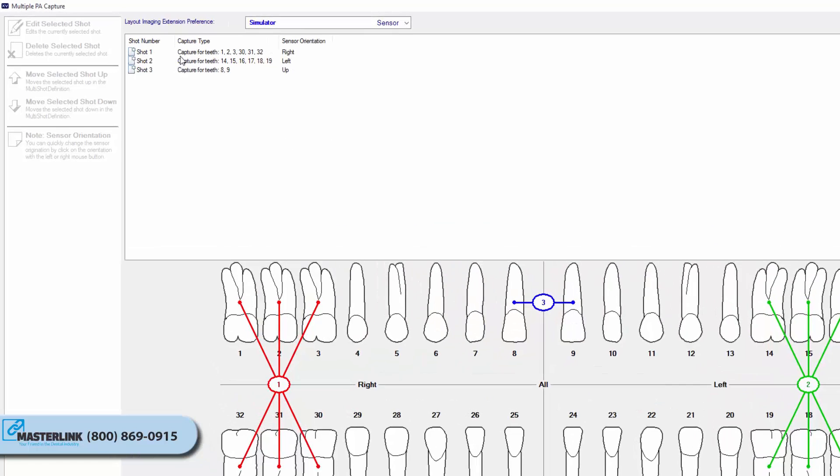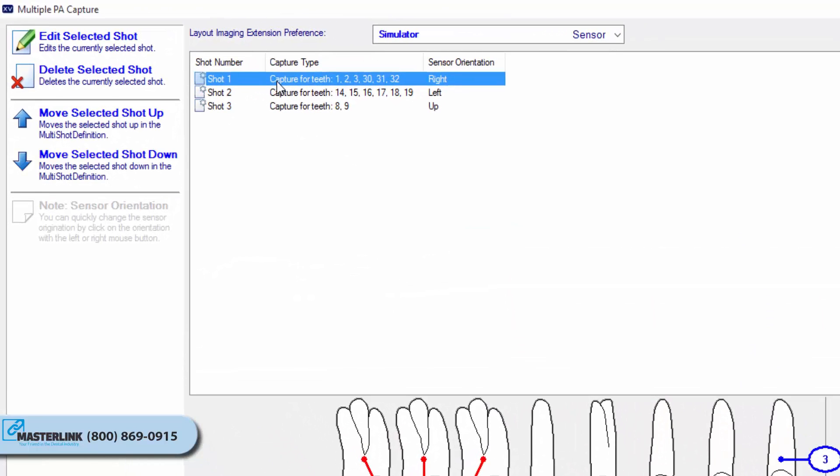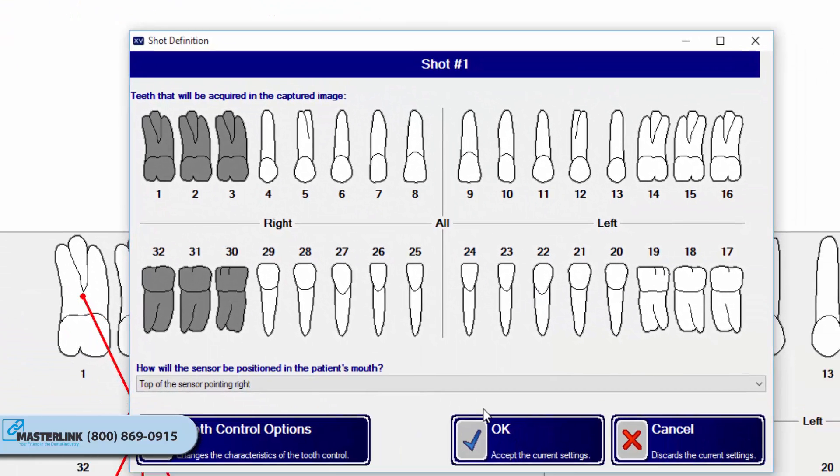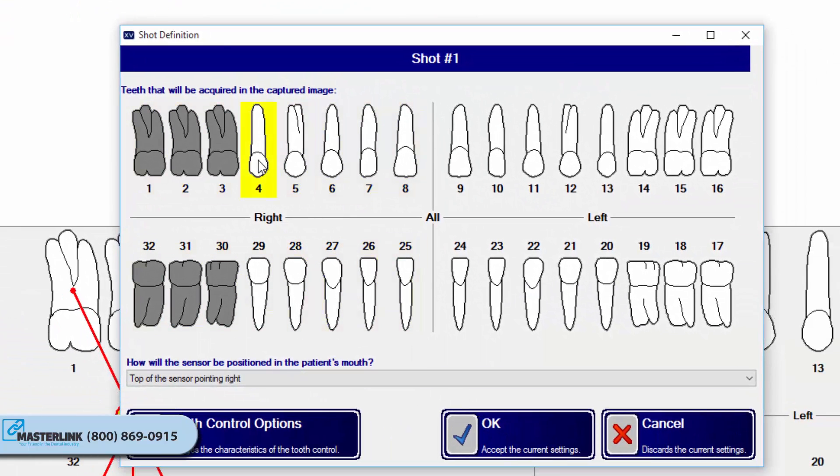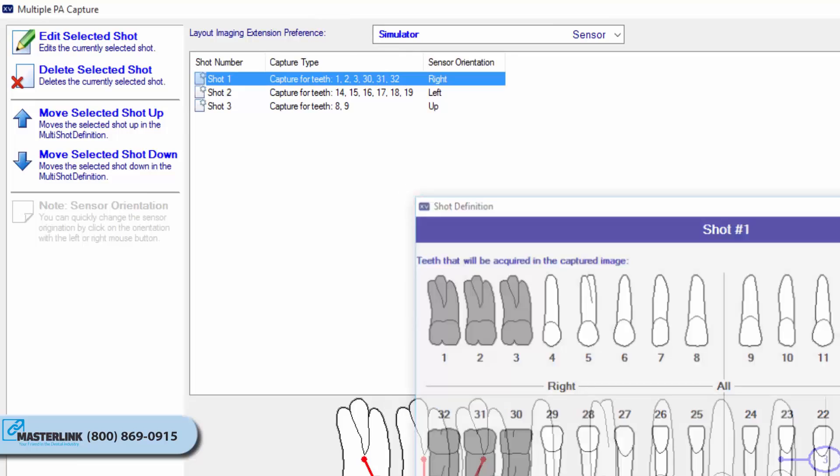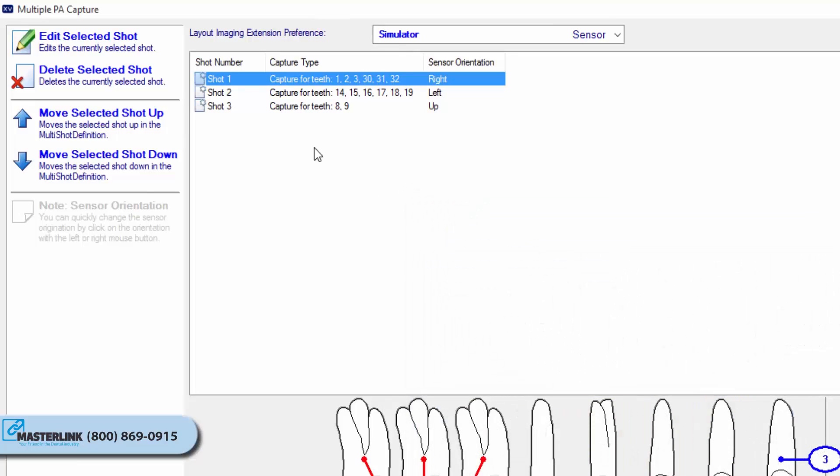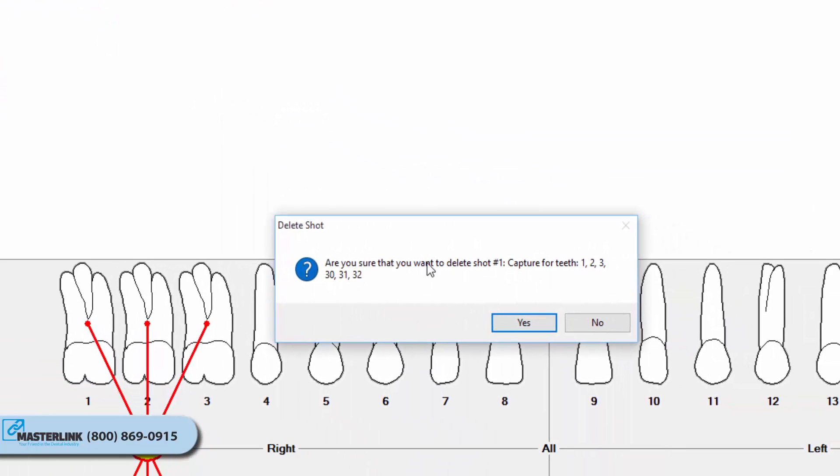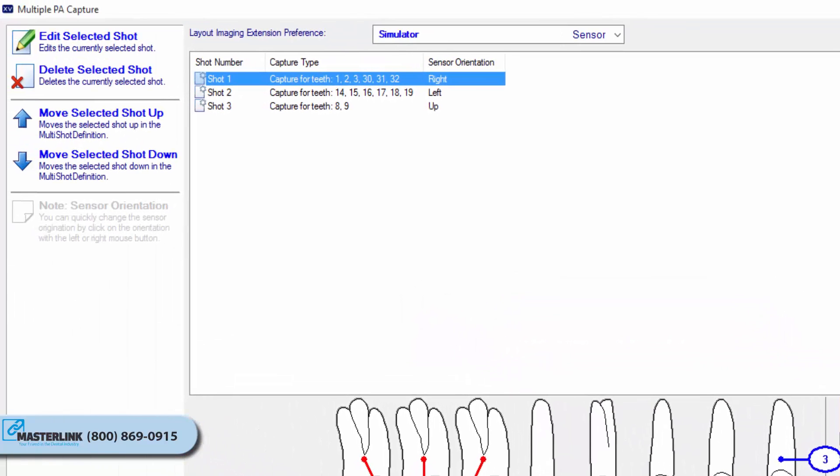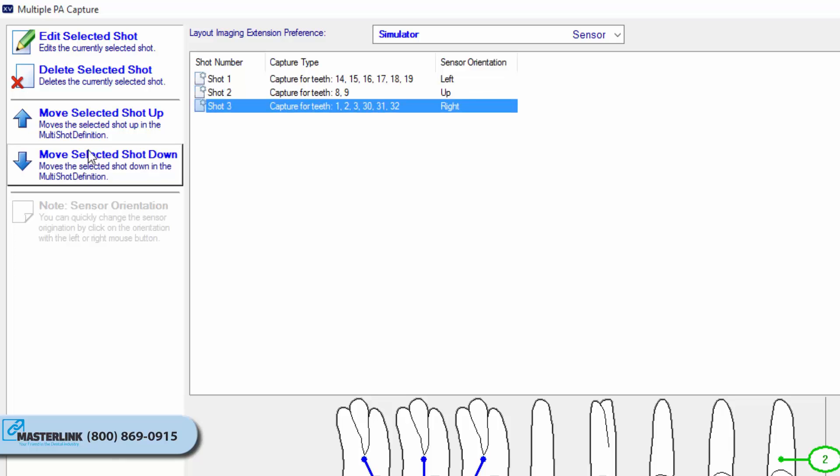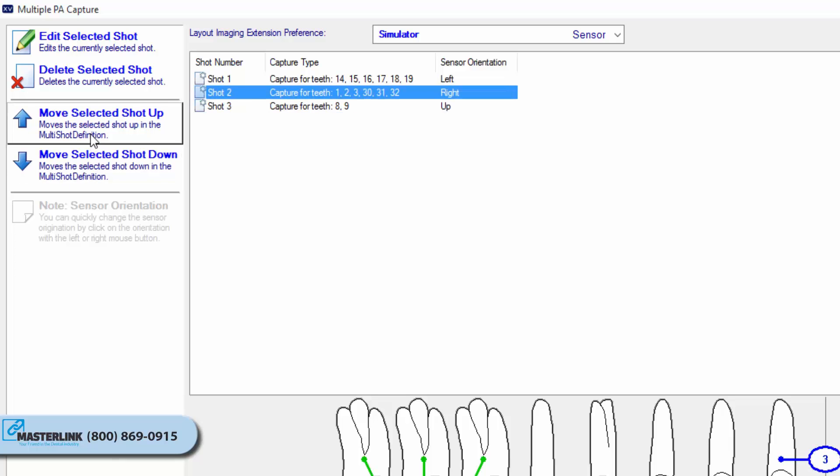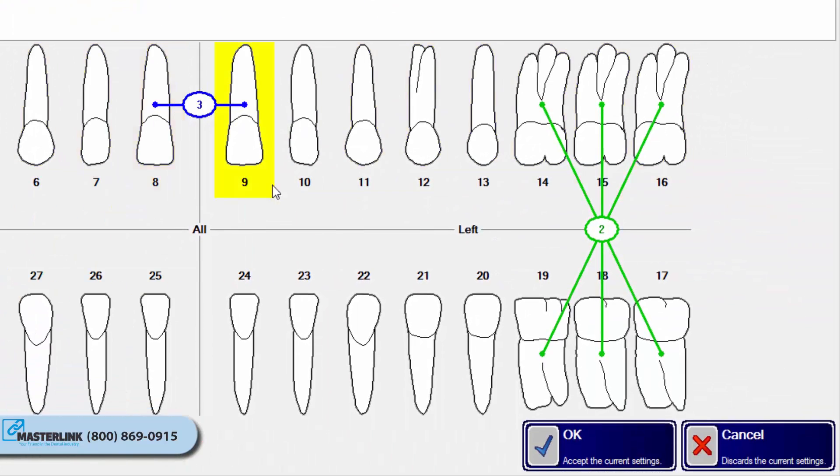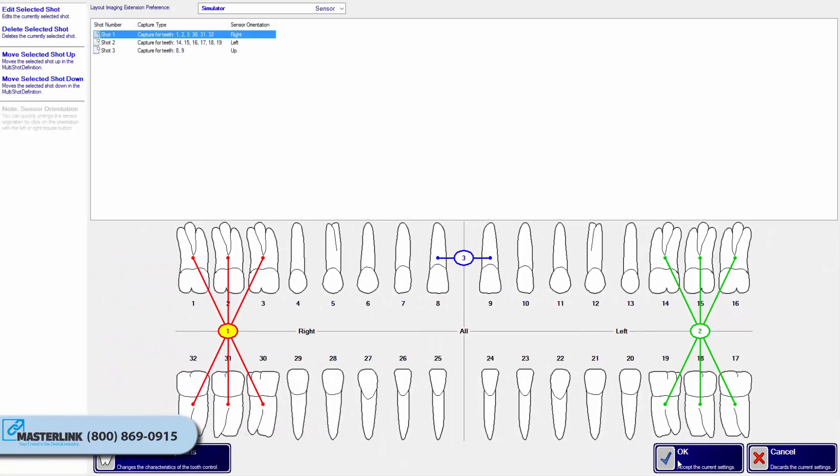Once shots have been created, there are several options that can be used to manipulate them. The Edit Selected Shot button allows the user to change the tooth associations of the shot, as well as the sensor's orientation in the mouth, if desired. The Delete Selected Shot button will delete the currently selected shot from the series list. The Move Selected Shot Up/Down button will move the selected shot up or down in the series order.